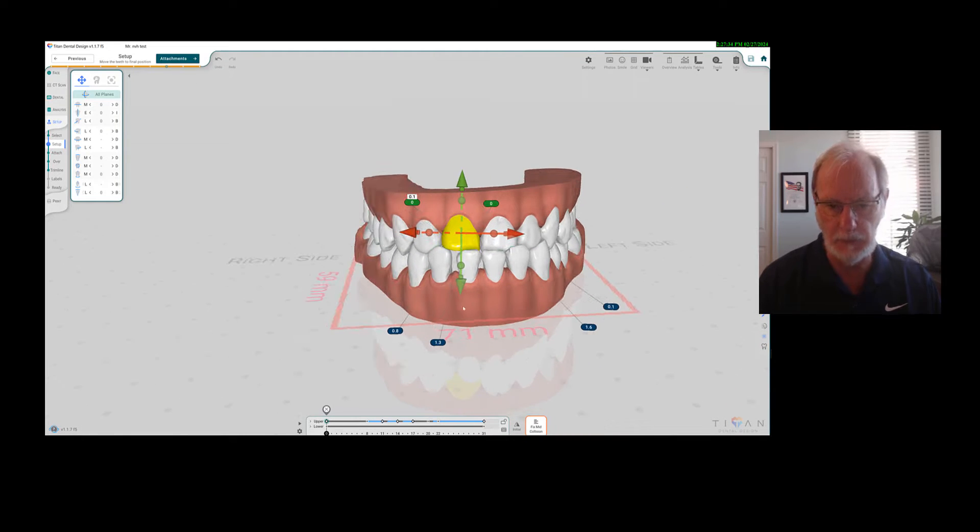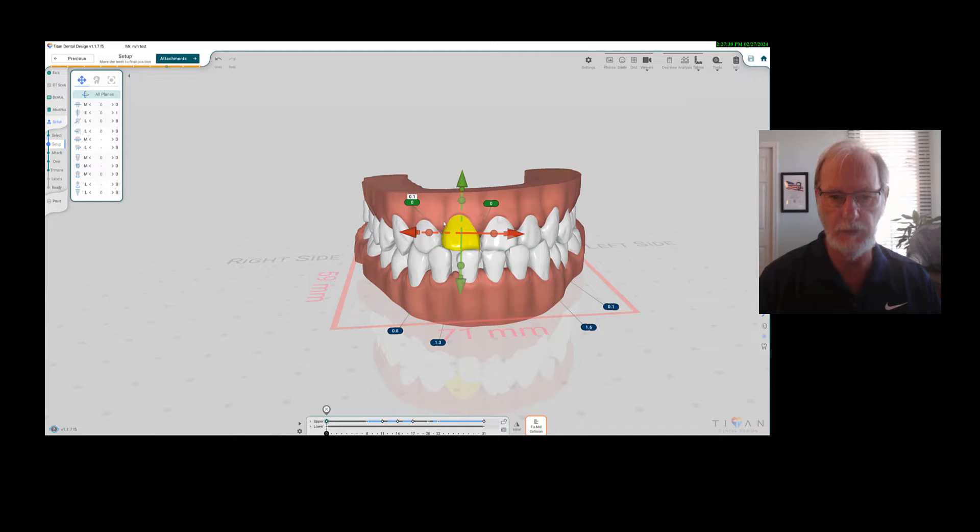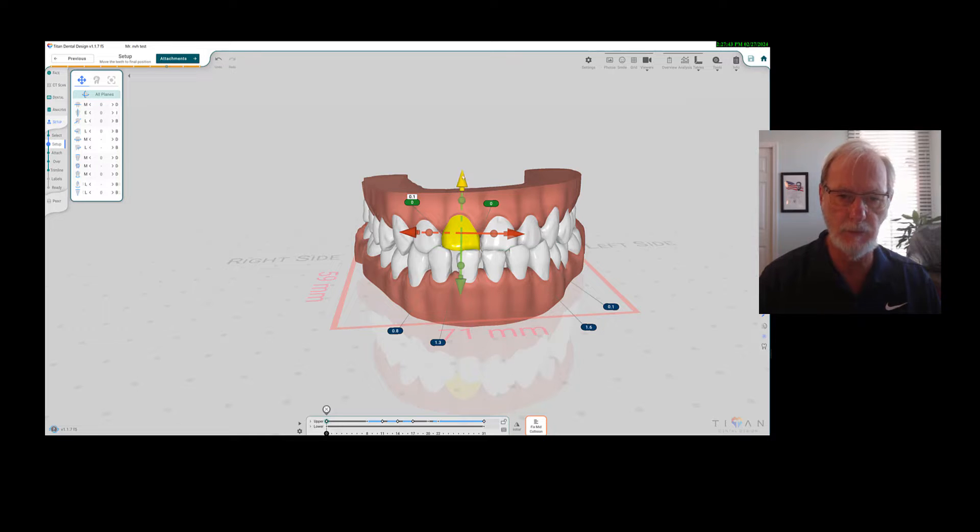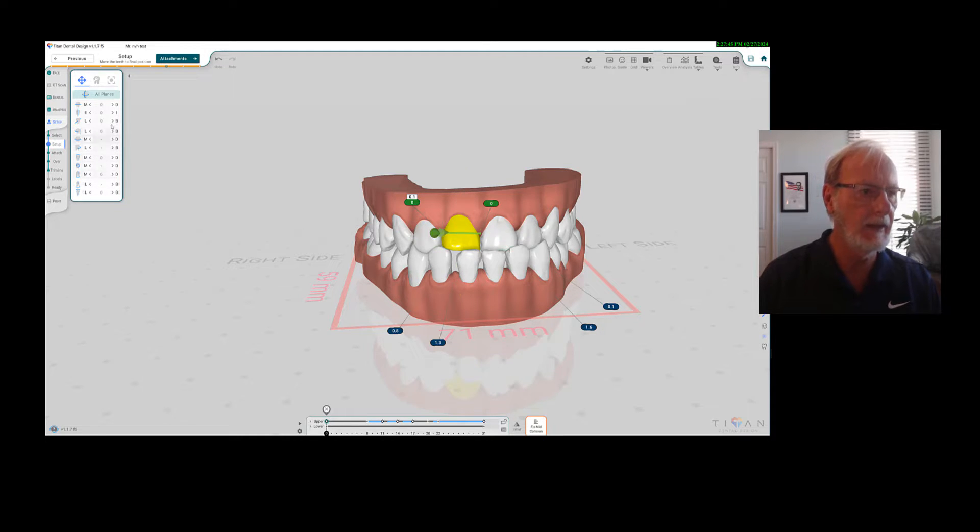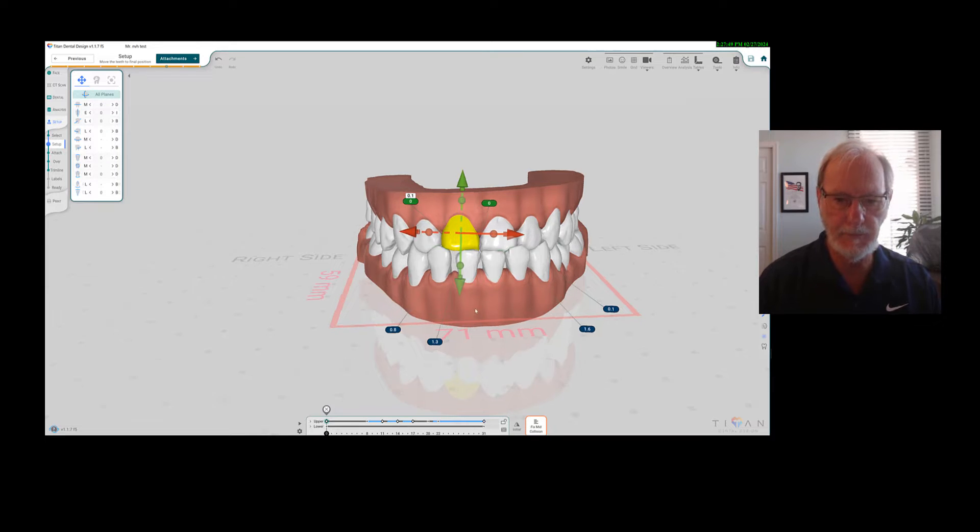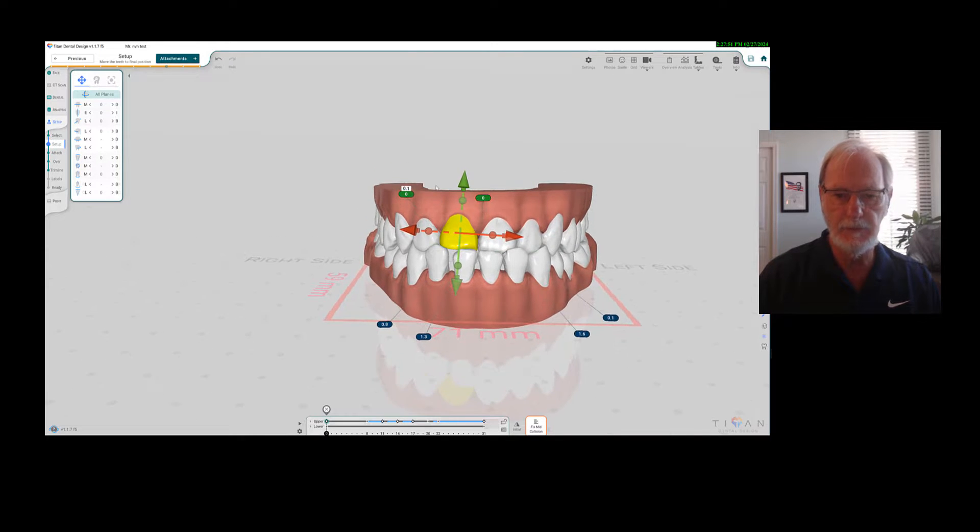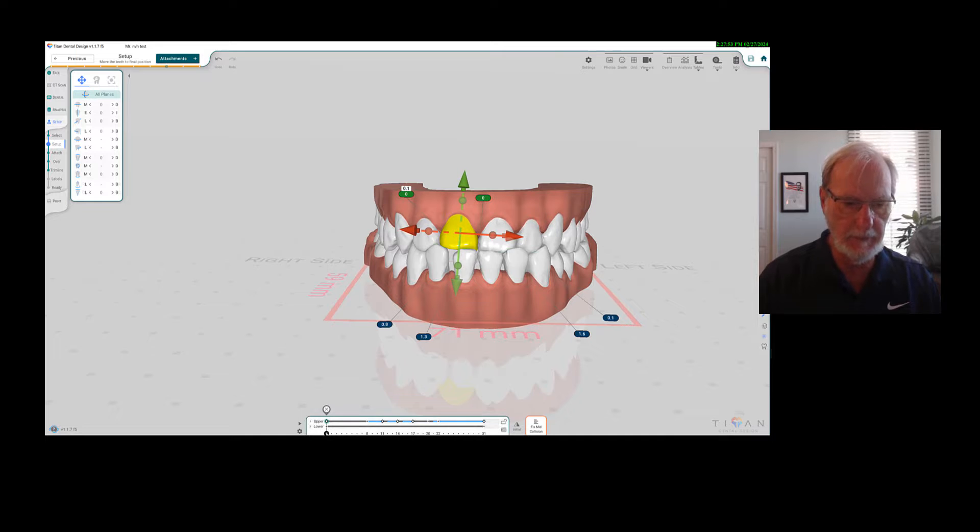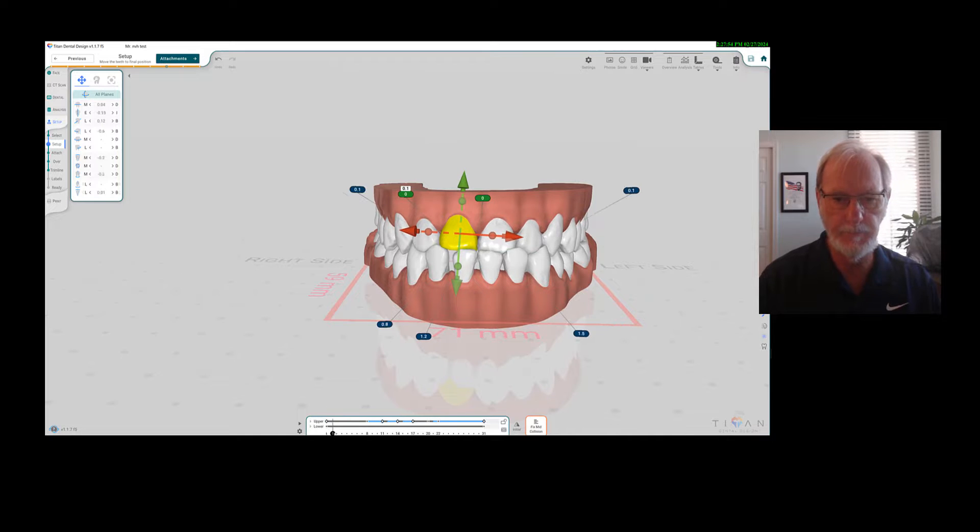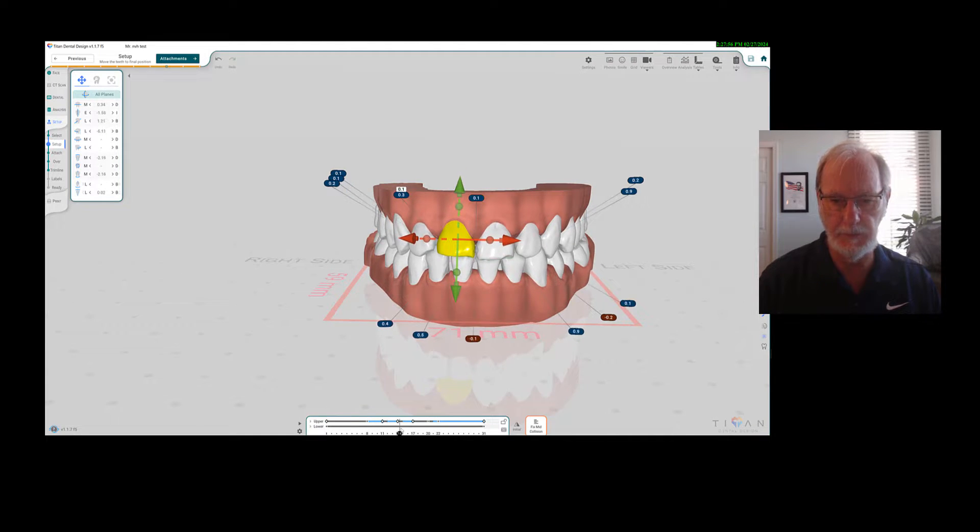What I would like to have is an option to select where I want the tooth to rotate around, could be the incisal edge, could be the center of resistance, center of rotation, or the apex. I didn't see it anywhere, maybe I missed it. These are the movements. I'll show you what I've done with this case in particular.